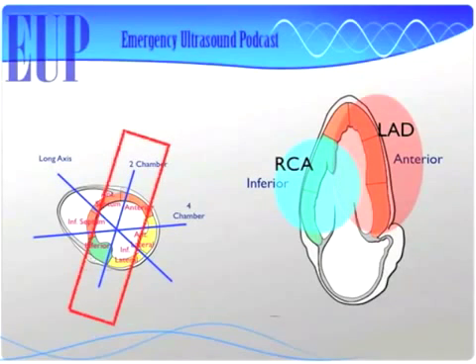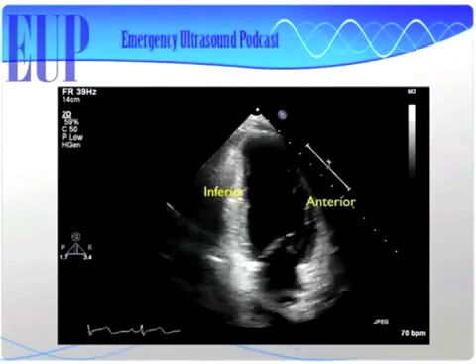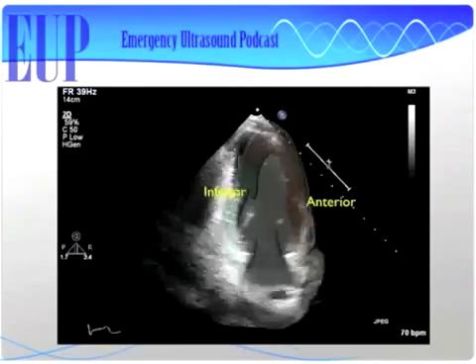So yeah, so that's RCA. So this is LAD and RCA distributions. All right, and here's the live version: anterior inferior wall.